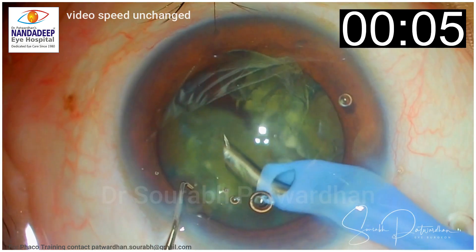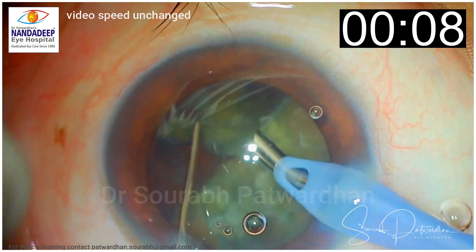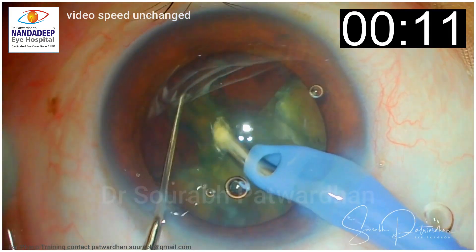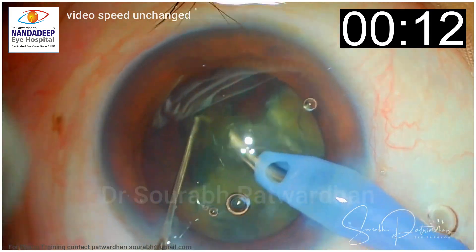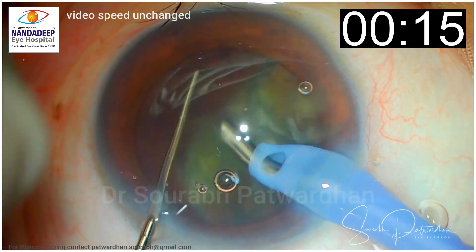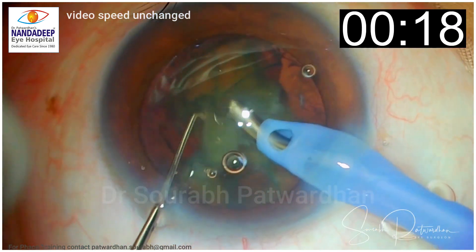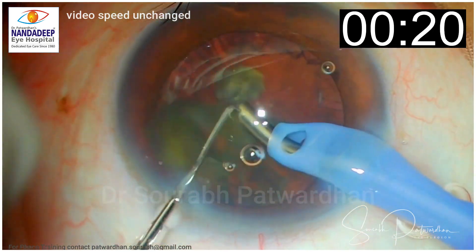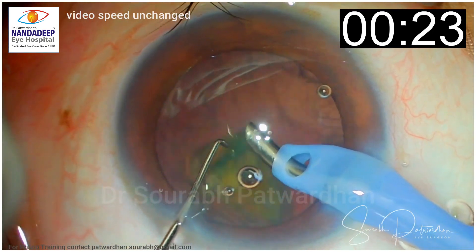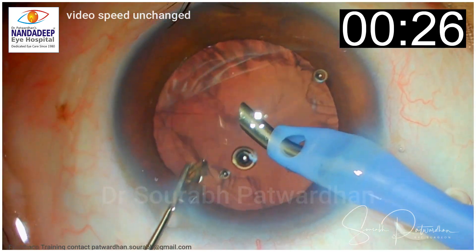Of course, doing surgery very quickly is not the aim, but doing each and every step more efficiently and in a very systematic and safe manner is the key. I want you to particularly analyze this step very closely and do write in the comment section what are the key factors in such an efficient quadrant removal.